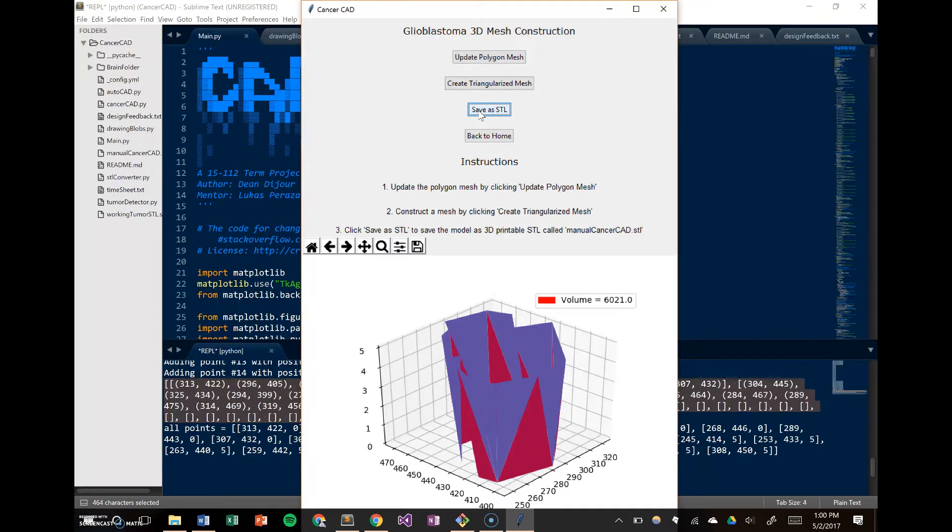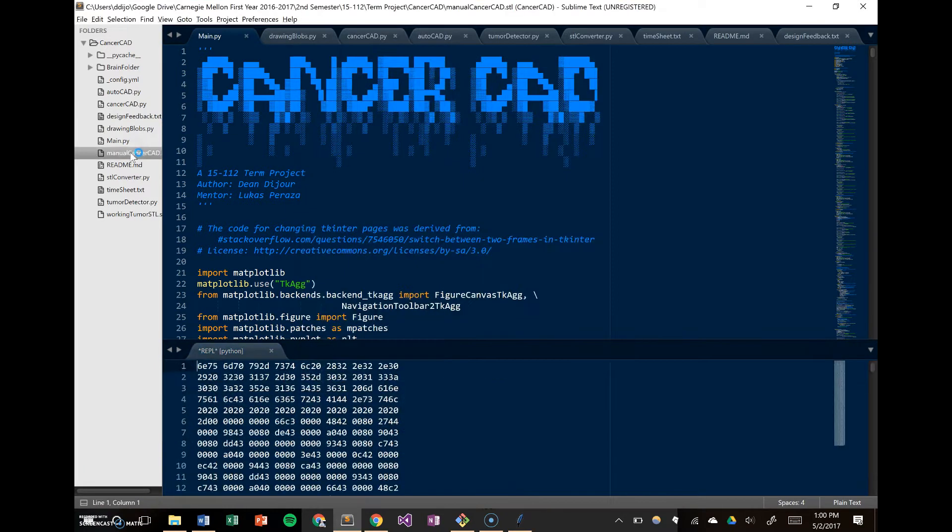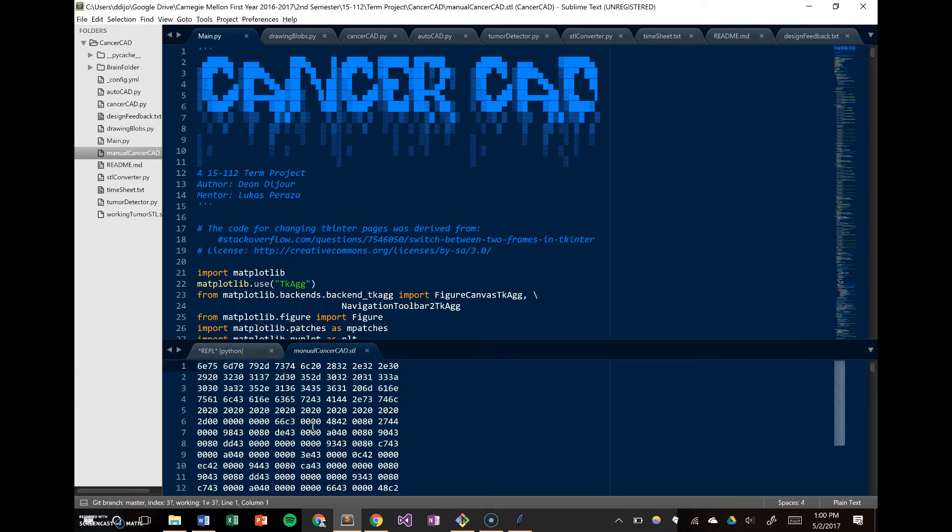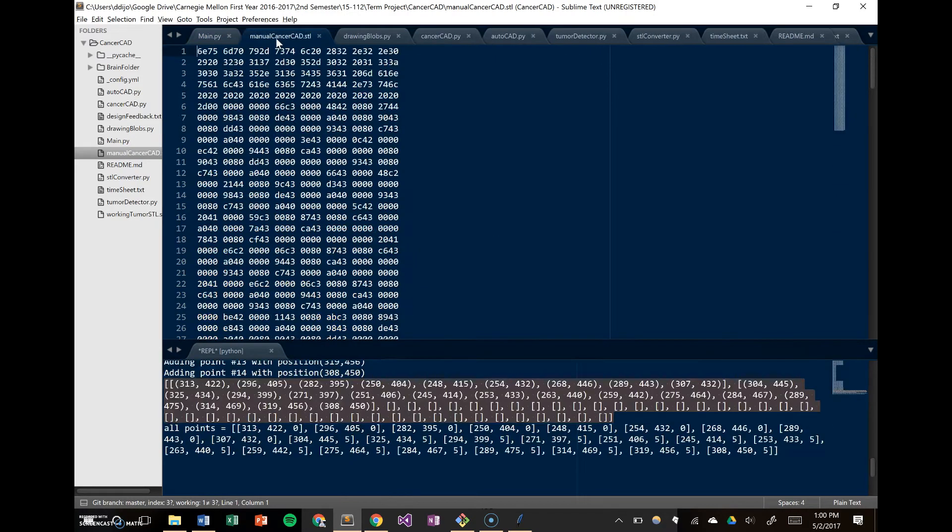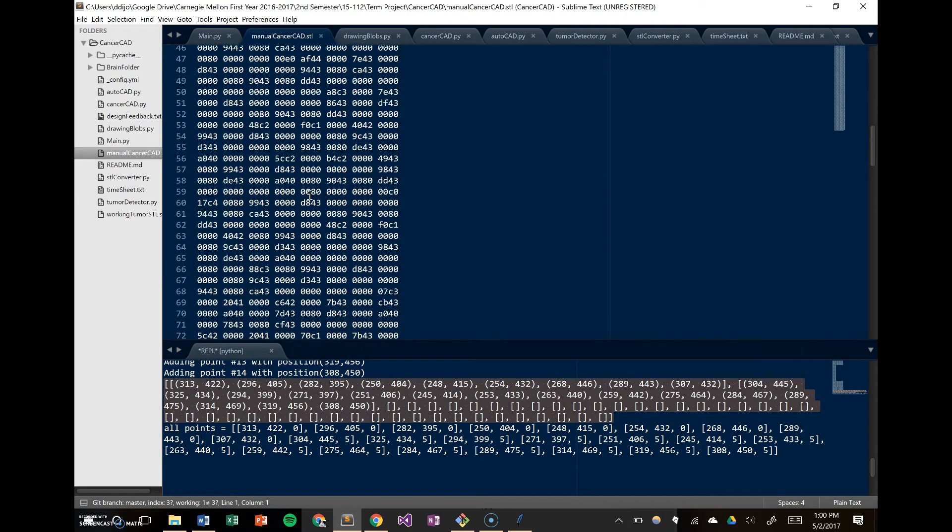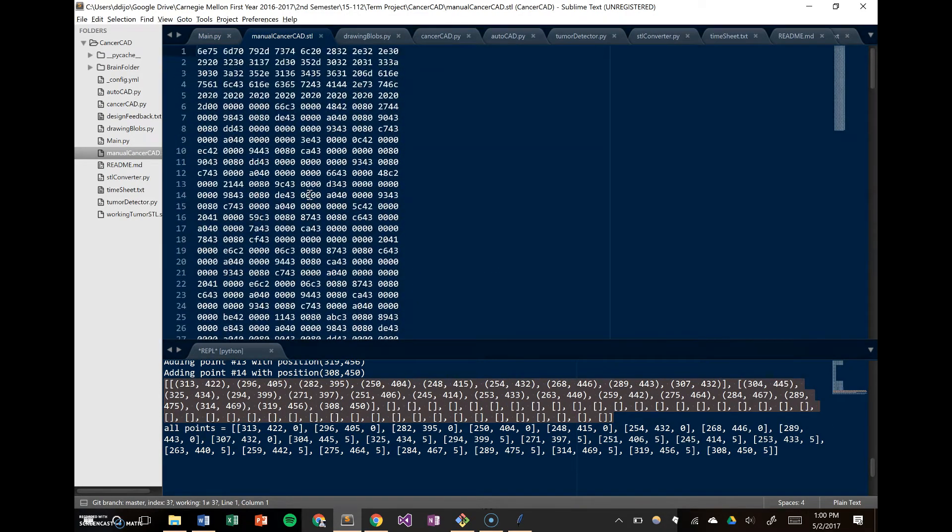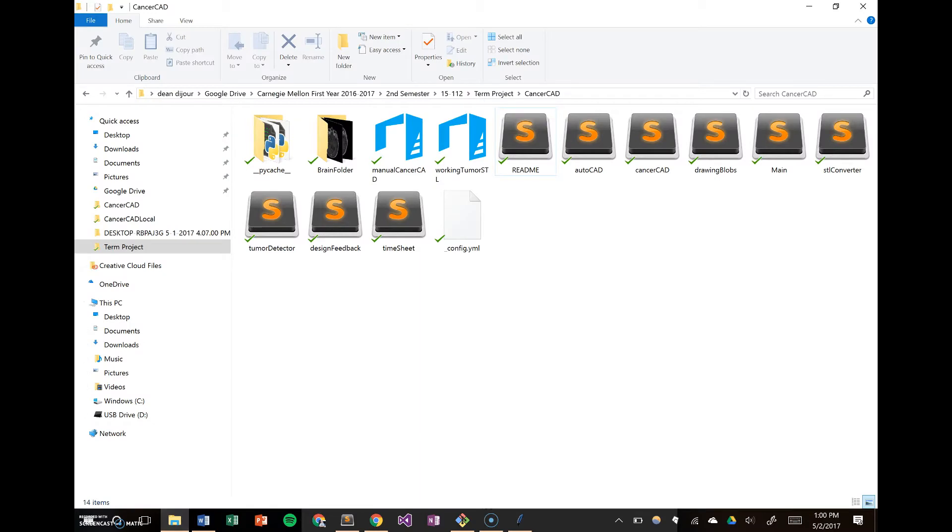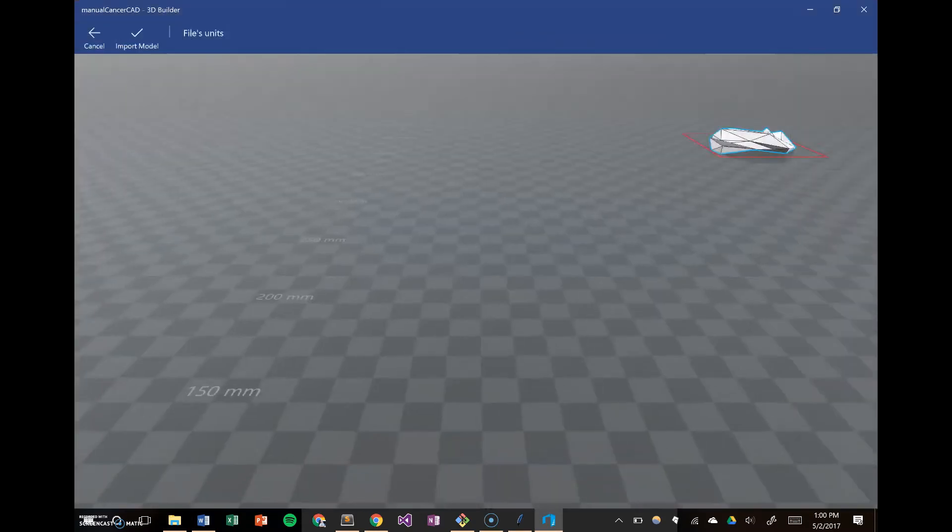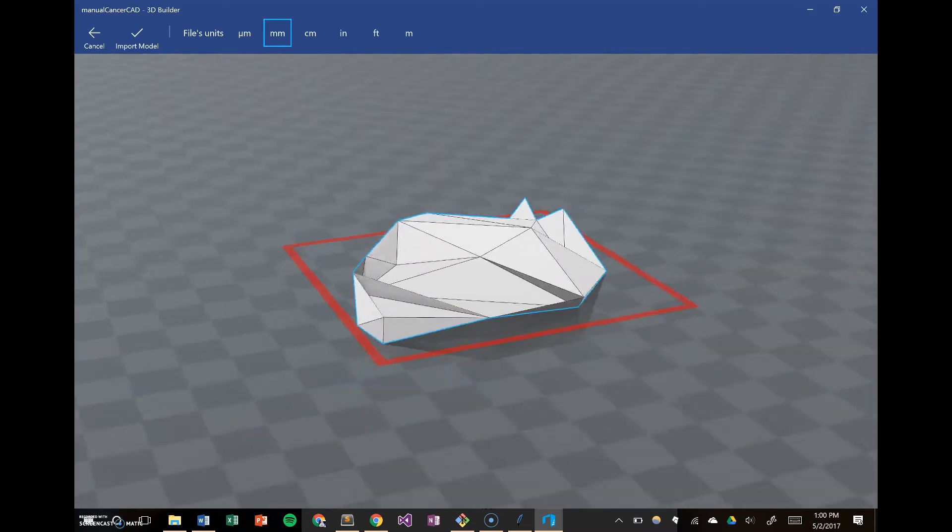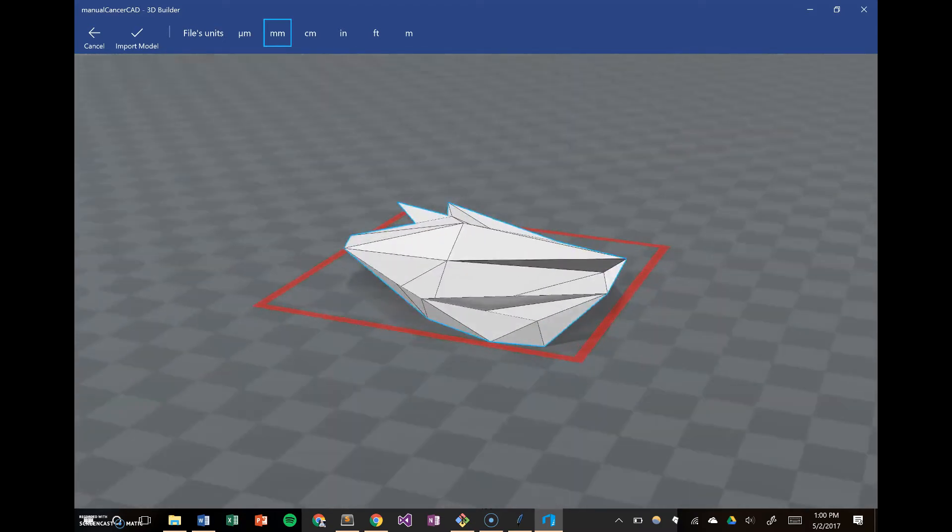Then you can save it as an STL. If we open up this STL in sublime text, it really won't be that meaningful. It's just a bunch of letters and numbers. But if you open it up in an STL viewer, like the one that comes standard in many Windows 10 devices, you'll start to see a 3D mesh emerging.